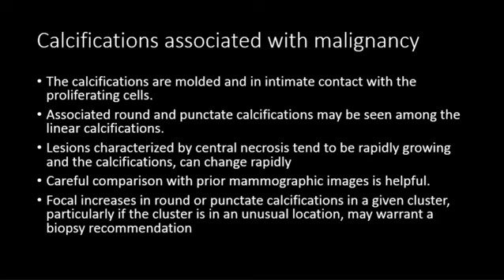Focal increase in the round or punctate calcification in a given cluster, particularly if the cluster is in an unusual location, you need to do a biopsy. If it is in some location that's not typical for benign calcification, if it is changing, you do a biopsy.